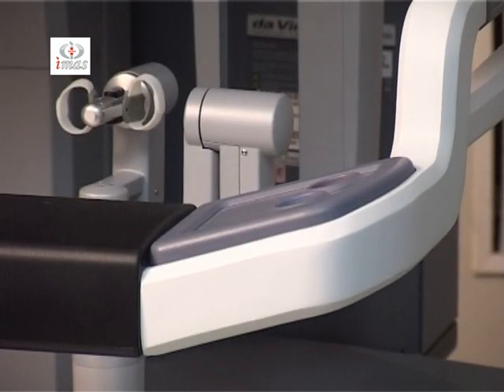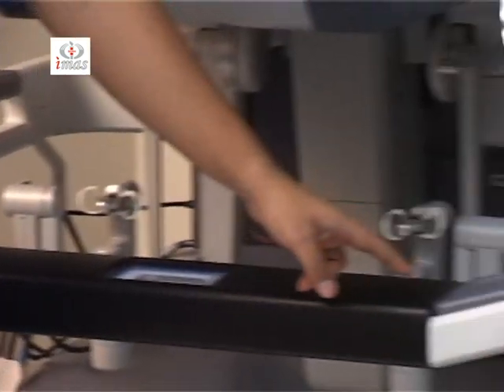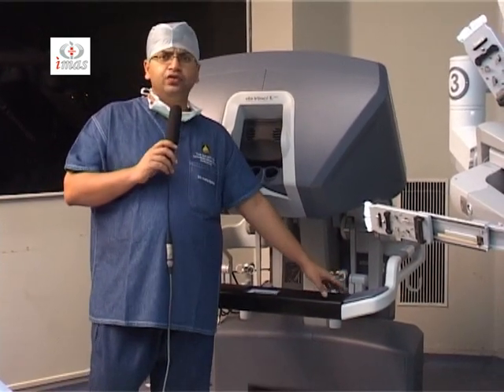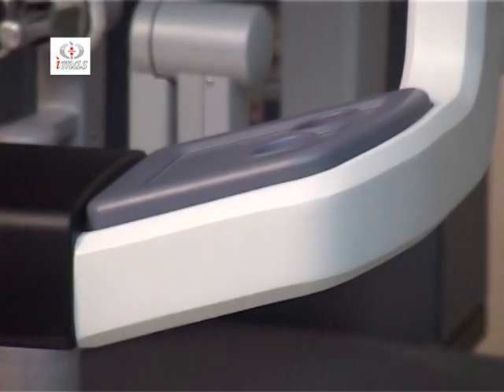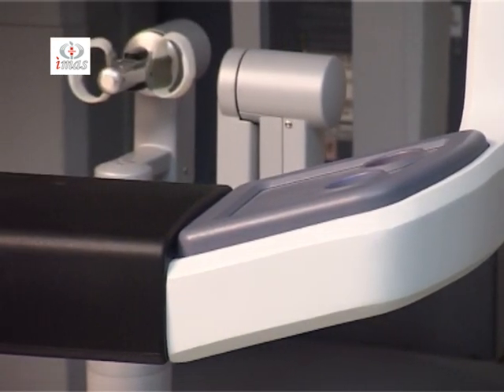This is the armrest, which contains the left side pod and the right side pod. The right side pod contains the power button, which has to be pressed in order to switch on the entire system. And it contains an emergency stop button, which can be pressed in case the surgeon wants to freeze the system there and then.